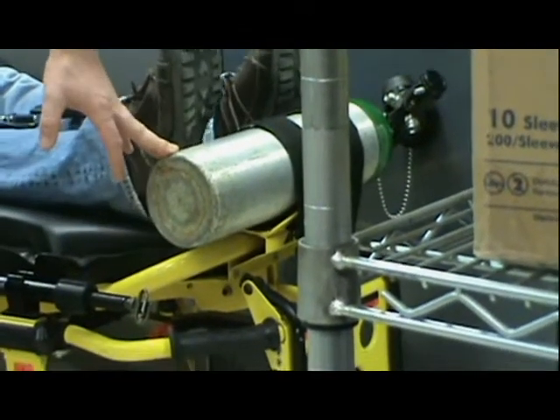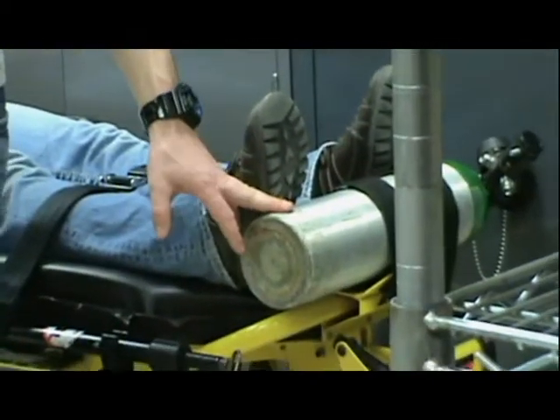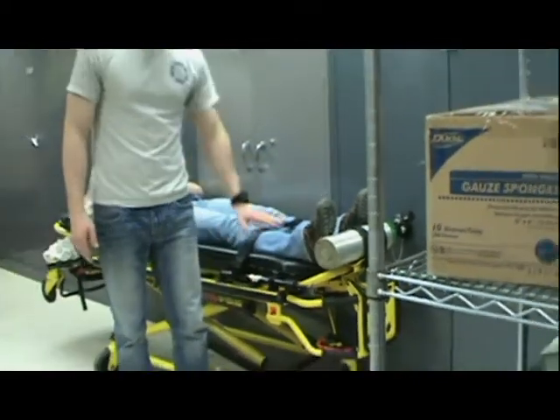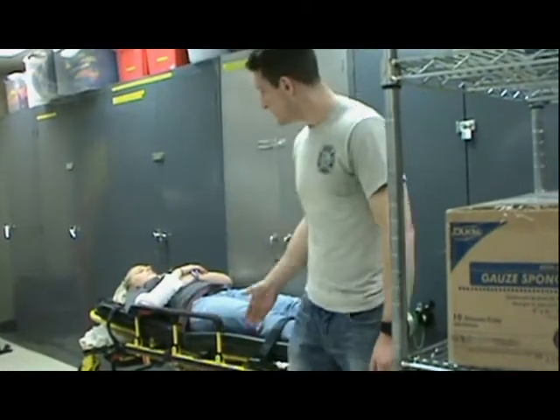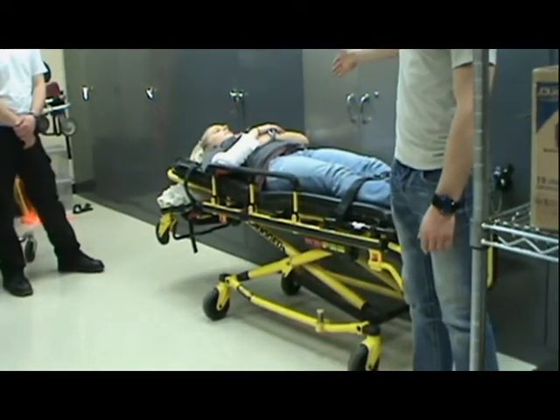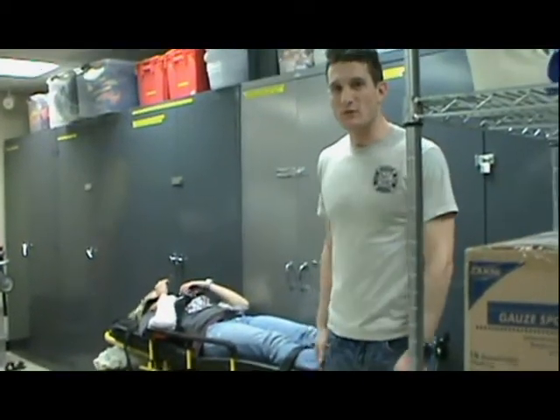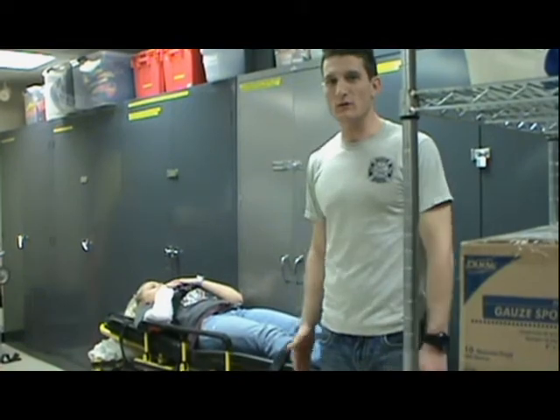The tank — if the patient is taller than Jackie, you have to remove it. If they're on a backboard, you have to remove it because the backboard won't fit. Always remember your patient has to be strapped in with the leg straps, the hip strap, and then the shoulder harnesses before you can lift, lower, or transport.